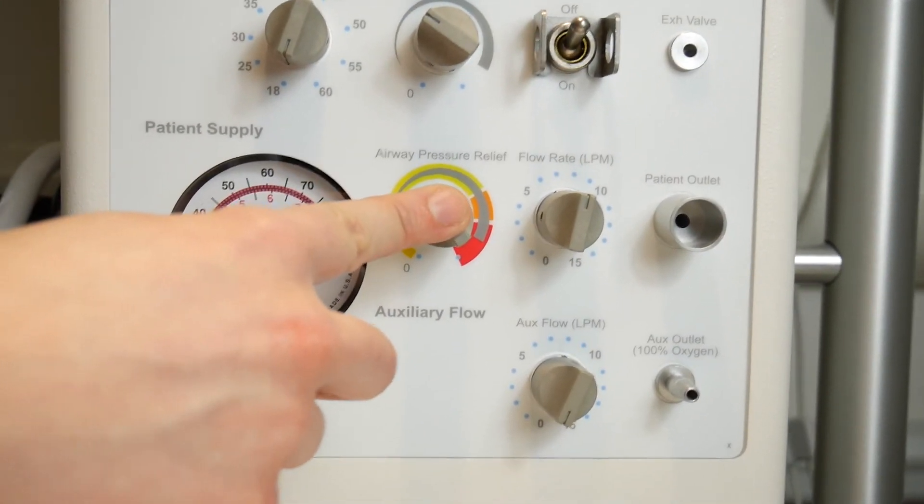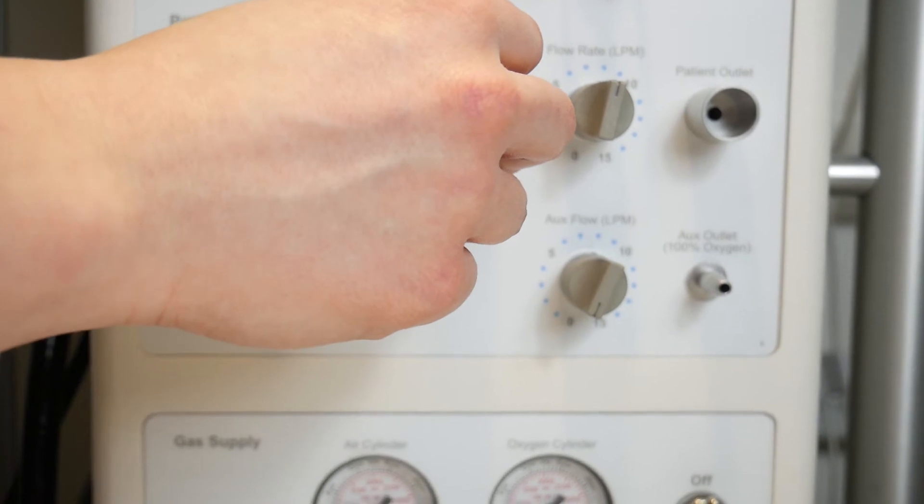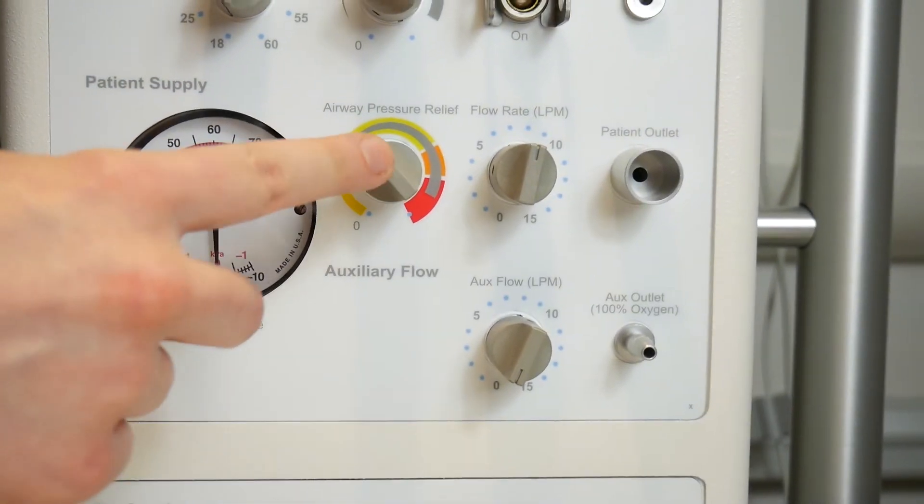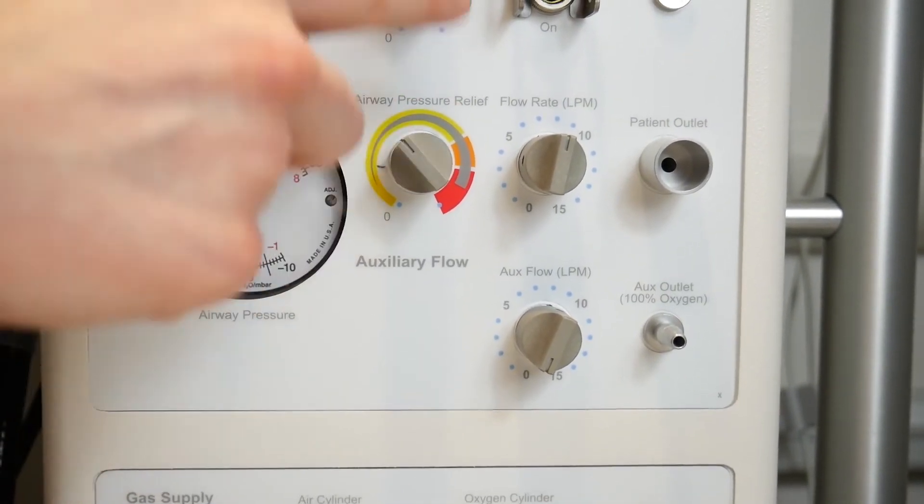This dial is the airway pressure relief or the peak inspiratory pressure. Most people like to set this at a maximum of 30 to begin with.